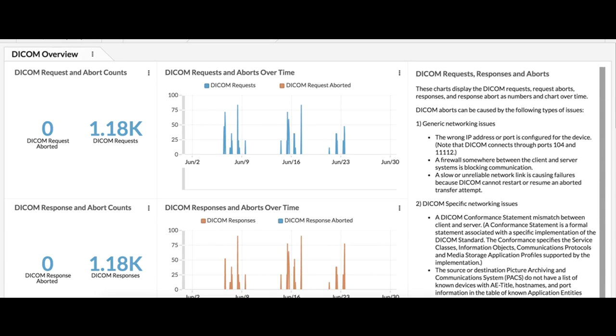Dicom is a binary upper level protocol over TCP and uses standard ports like 104. Dicom has metadata containing the patient and provider information and the image data. The setup for Dicom can be on-site in hospitals or off-site as a radiological service. A Dicom environment has a radiology information system called RIS or a hospital information system called HIS, a modality worklist server, a picture archiving and communication systems server called PACS, and client workstations.